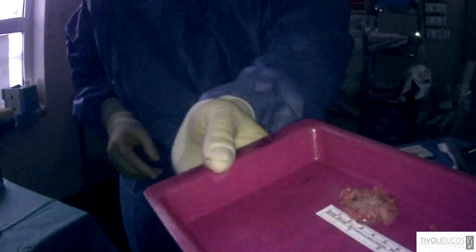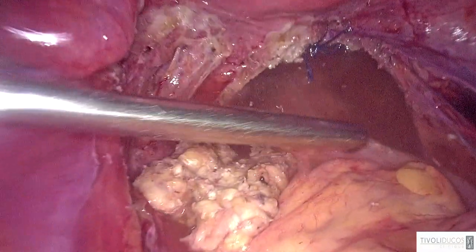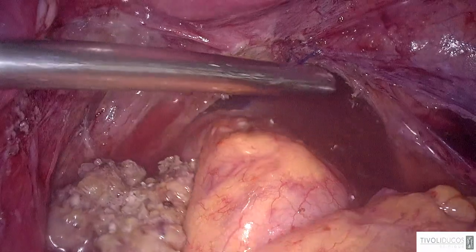And now we'll test the suture. They want to show you the pieces we remove. Okay, so the suture is 6 centimeters above the anus, so it is a mid-low rectum. And we removed a piece of 4 centimeters in diameter. Bravo. Now, he will push air into the rectum, and we'll do the bubble test. We'll see whether or not we have bubbles. No bubble.